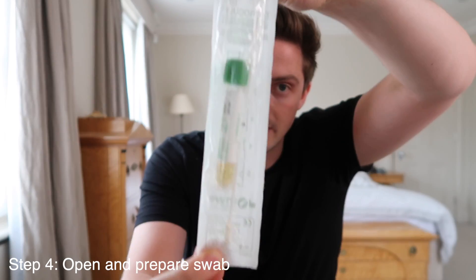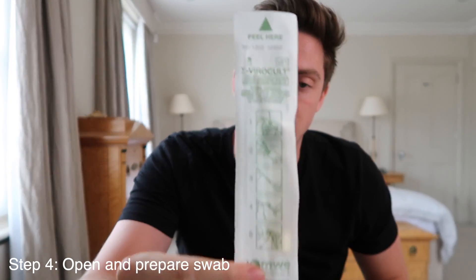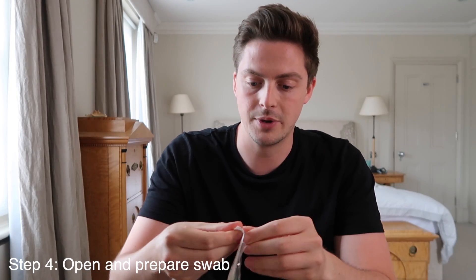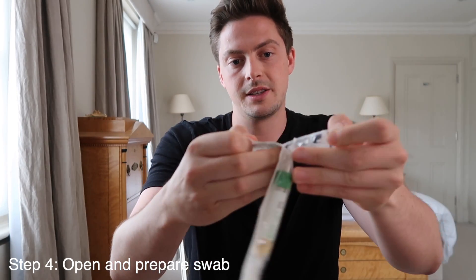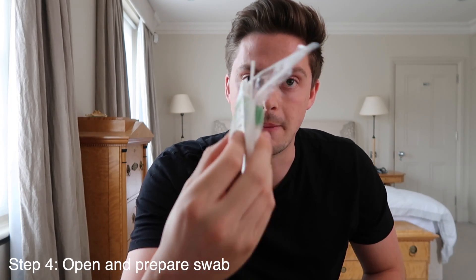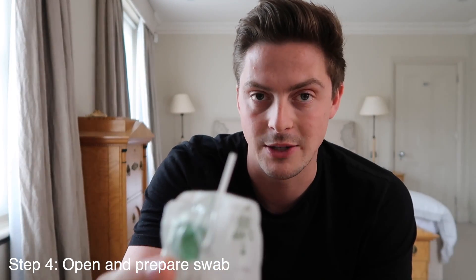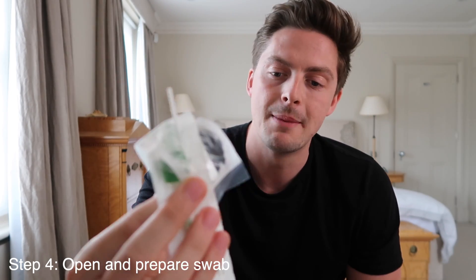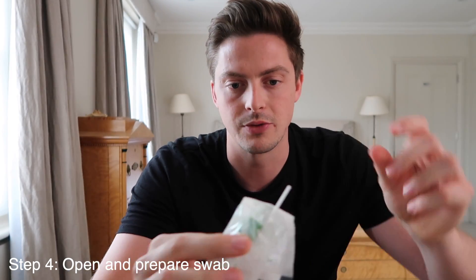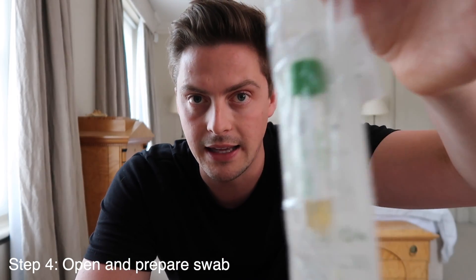Now let's take the swab. Get hold of your swab kit. There are instructions on the back if you're unsure how to open it — you peel it at the top to expose the base of the swab stick. That's what you'll be holding. It's very important you don't touch the other end of the swab as you can contaminate the results. You'll also see there is liquid in the pot — that needs to remain in there, so be very careful.